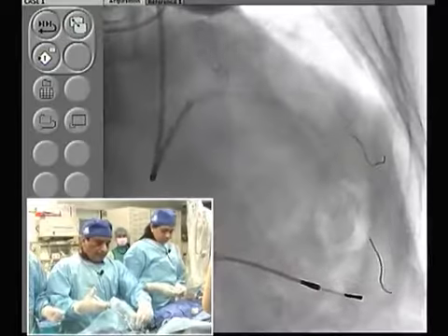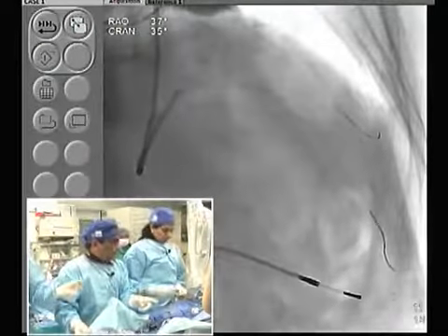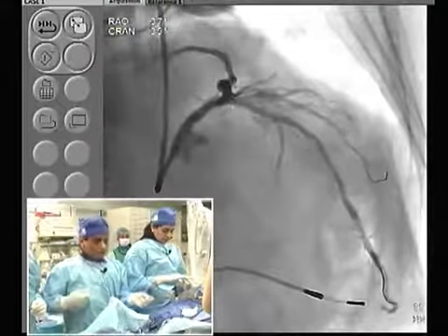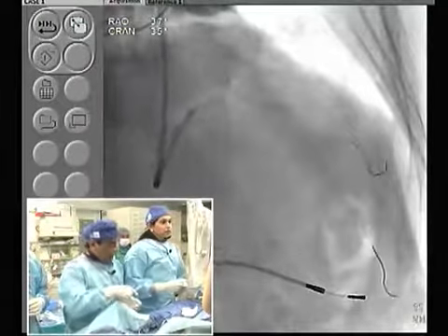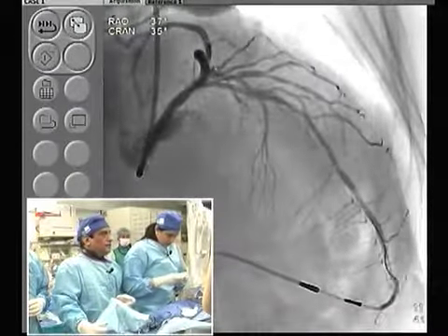Okay, now the key is that we are going to just take care of the diagonal. So I think it came from here. Yeah, one or two bubbles did go, but the patient is fine. It sometimes happens with these two wires. I did aspirate, but I needed to be a little more aggressive. I heard the noise, I think.